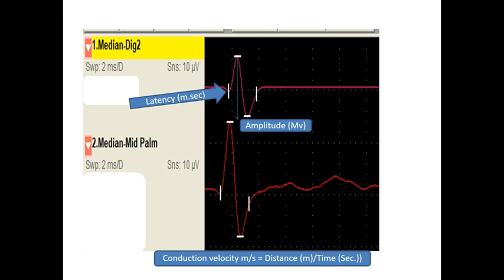The recording electrodes are placed on the wrist over the median nerve. The normal values of latency is again 3.6 milliseconds, and amplitude is 8.91 plus or minus 4.8 microvolts, and conduction velocity is 45.45 plus or minus 9.40. Thank you so much.